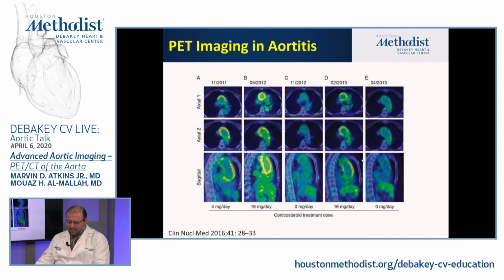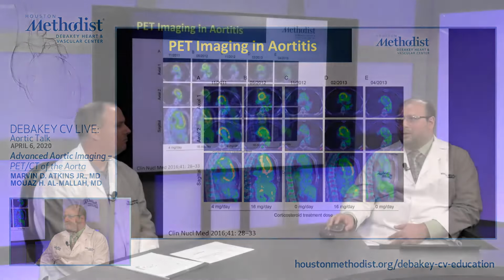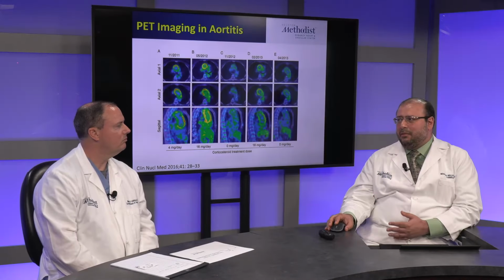Right. So yeah, this is where I would say PET-CT is probably the closest to clinical application for the aorta. And this is very helpful, as we said, not only for the diagnosis. CT also has some typical features in there, but sometimes you need to do contrast and you're going to repeat it and image the patient.